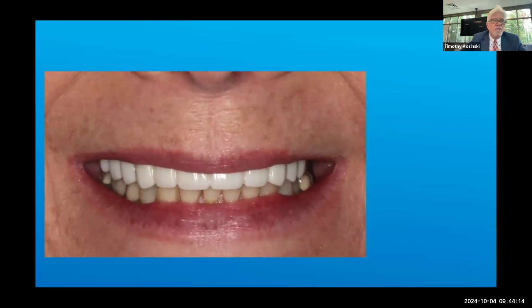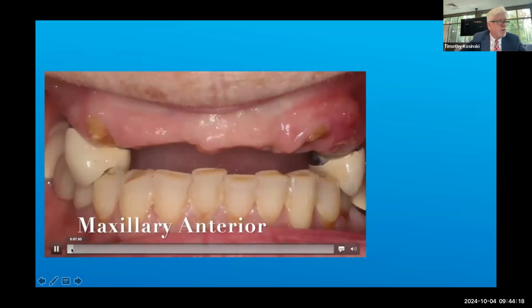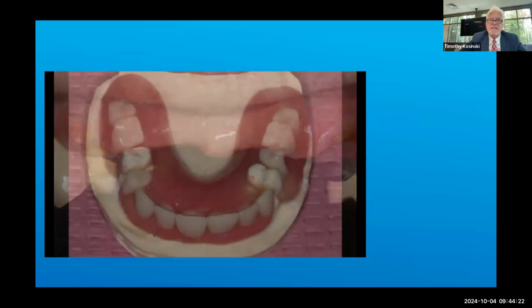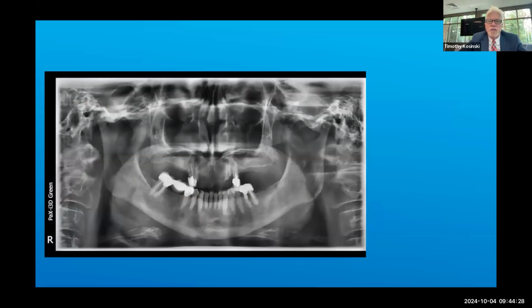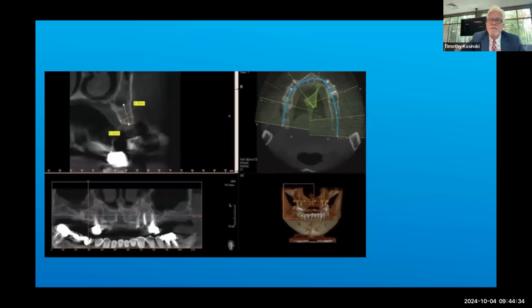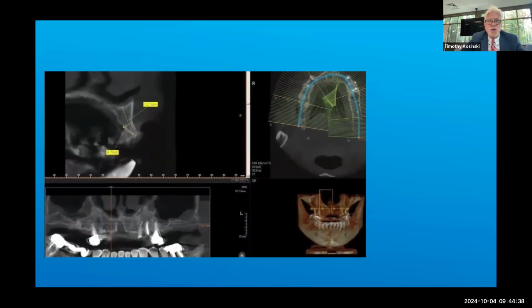This was just a wonderful patient, and I'm going to run through this relatively quickly to respect everybody's time. But we have a site that was edentulous for many, many years. And sometimes I'll do what we call sequential therapy. I will leave teeth that we will remove in the future for a flipper type of appliance as opposed to putting the patient in a denture.